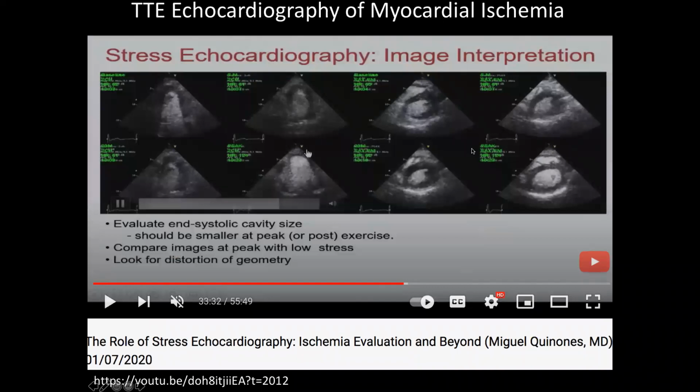Oh, here we'll just do one more thing. This movie, which I won't go back to, because it takes too long to get there. But does anyone notice something different about these ultrasound pictures? In particular, look at the intensity of the blood inside the chamber. What's going on here? All of a sudden we have white or bright blood images, right? And this is really cool.